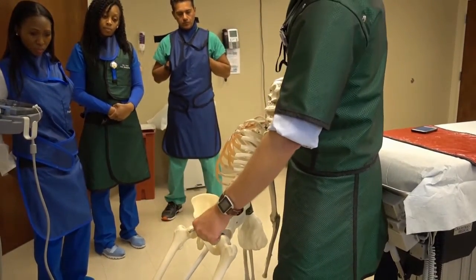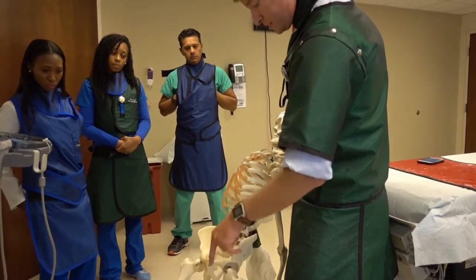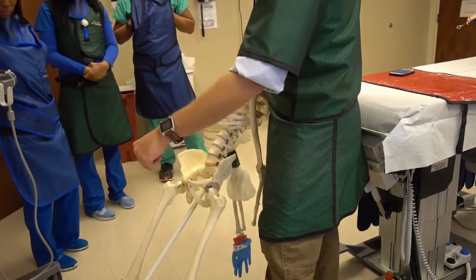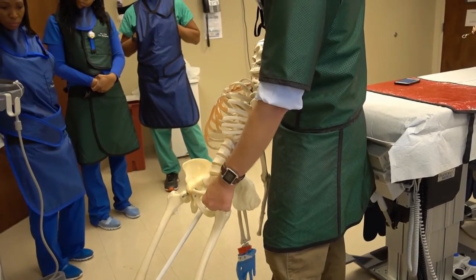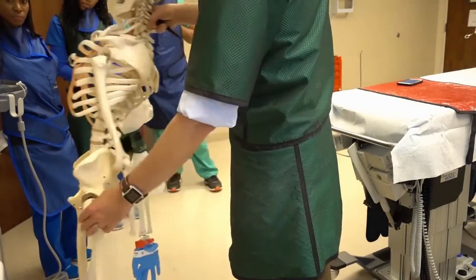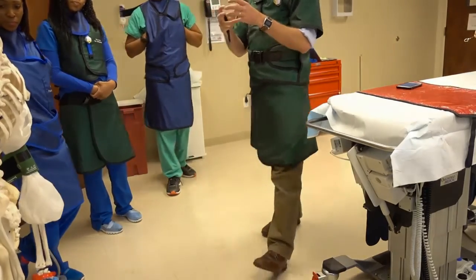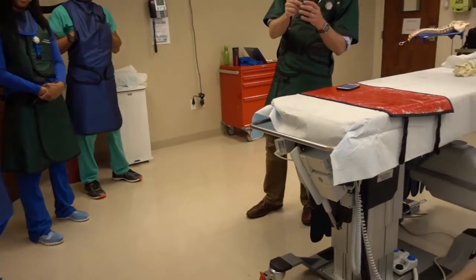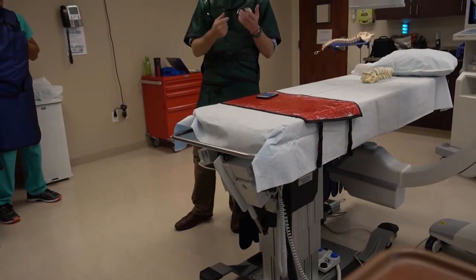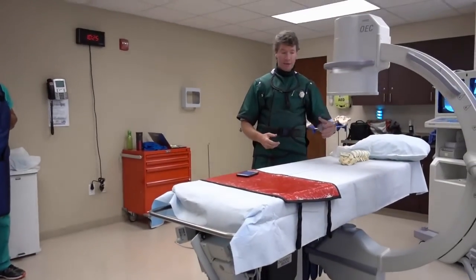Because of our anatomy, we start by numbing the skin over the trochanter, the intertrochanteric line, and then we come down like this. The femoral nerve and artery are coming right like here. So what the doctor generally does is start lateral, put a little bend on his needle, and then come medial, and he comes in and touches somewhere on the neck. There's a cup, so there's a sleeve all the way around. The Y ligament of Bigelow is what we call it. It wraps around that hip. So once the doctor's needle gets inside there, you inject, and you'll have a flow of contrast that goes wrapping around, kind of looks like a 7 ring. But generally what we want to do is position just like this, and then bring the hip in.